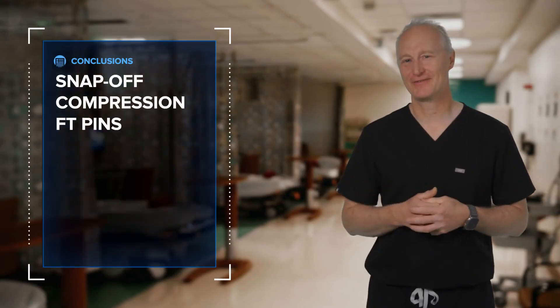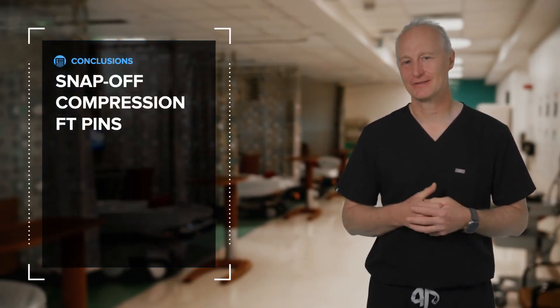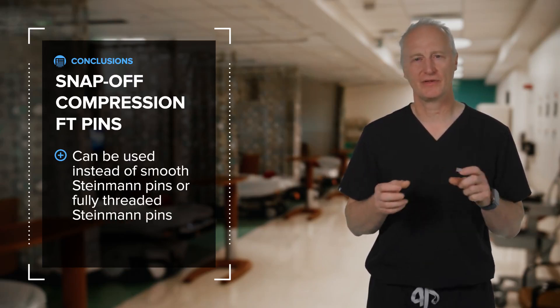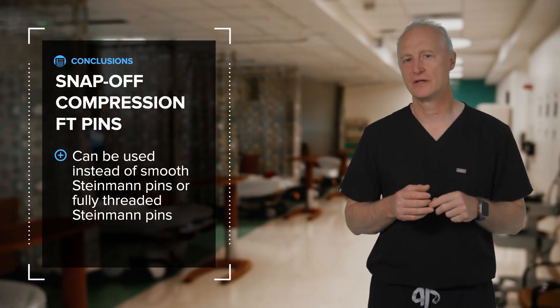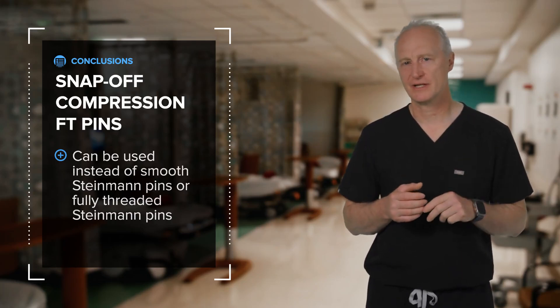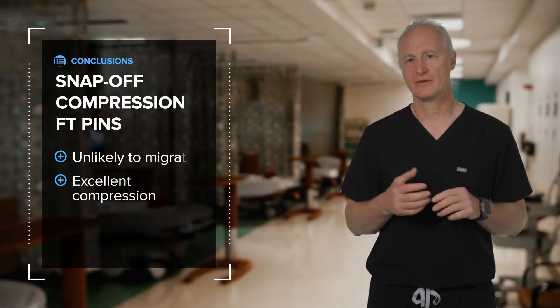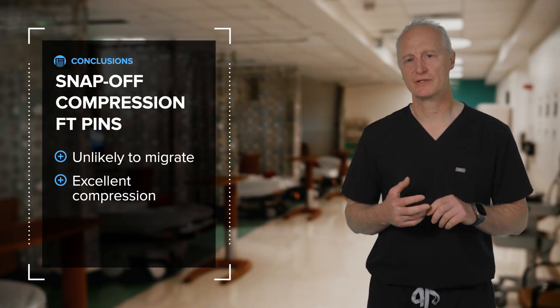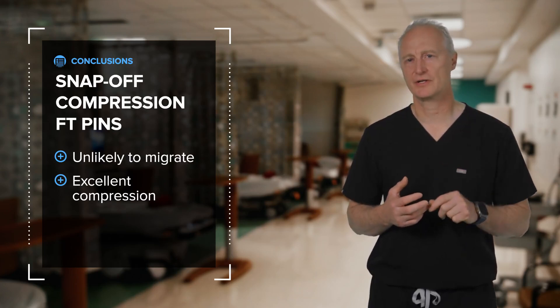In conclusion, why snap-off compression fully threaded pins? I would say, why not? In those situations where you might be thinking about using a smooth K-wire or a fully threaded K-wire, this implant should be strongly considered. It's unlikely to migrate and provides excellent compression, particularly across simple articular fractures. Thank you.